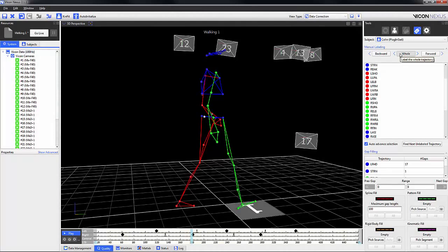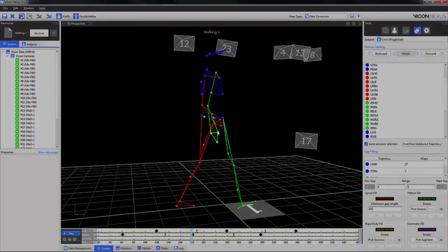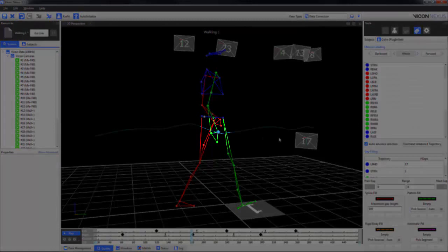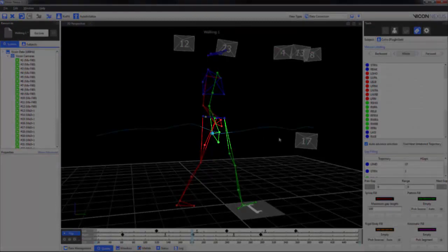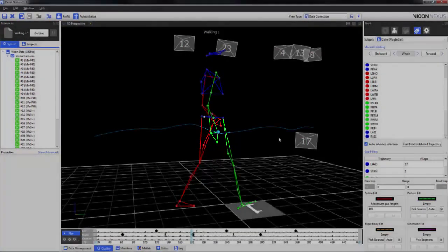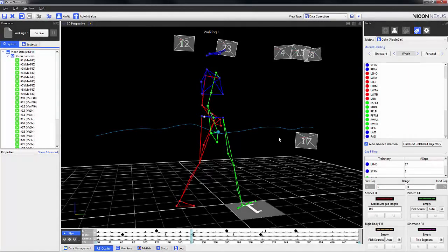In this example, we can see that the trajectories of the right wrist A and B markers swap over. To correct this, I select forwards and relabel the trajectories appropriately.